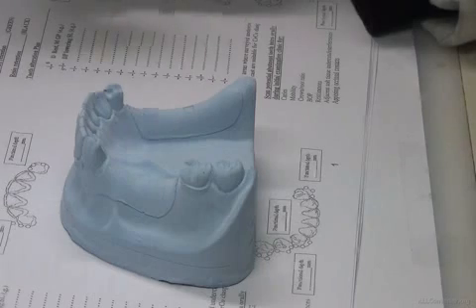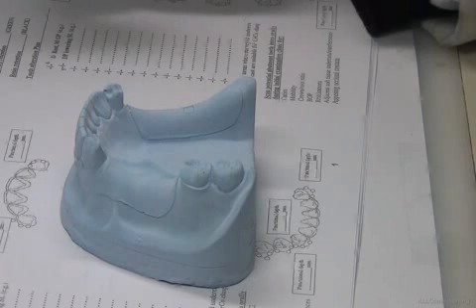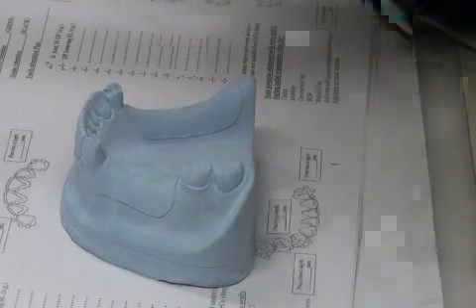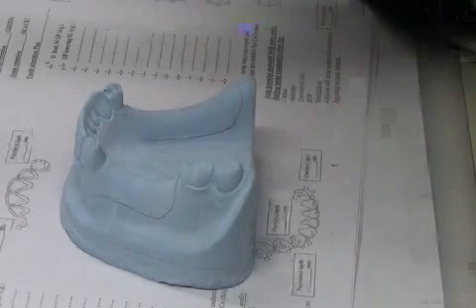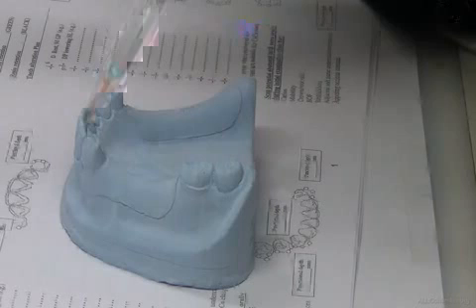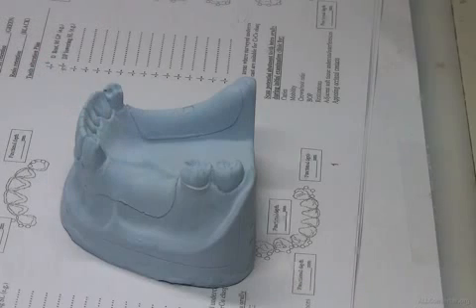Why? For aesthetics. This is design. This is what we mean by design. We change the very basic design based on some findings. One of the findings is that our abutment is a canine.